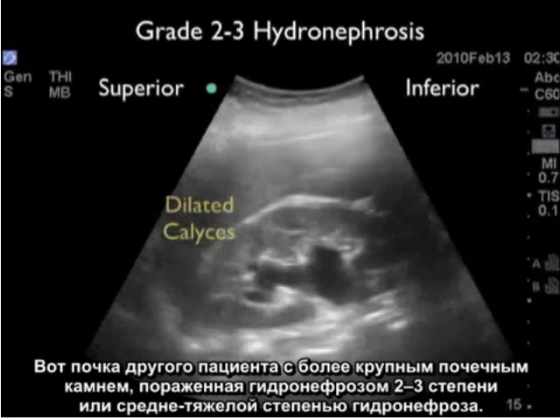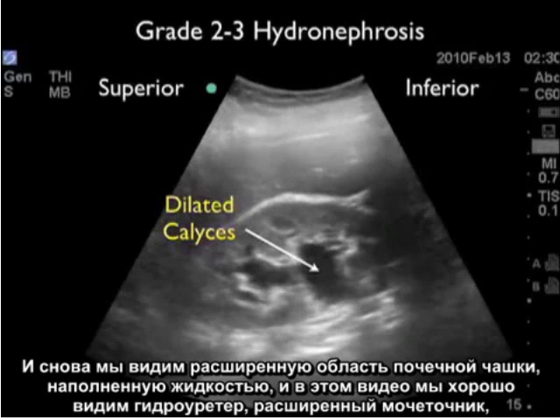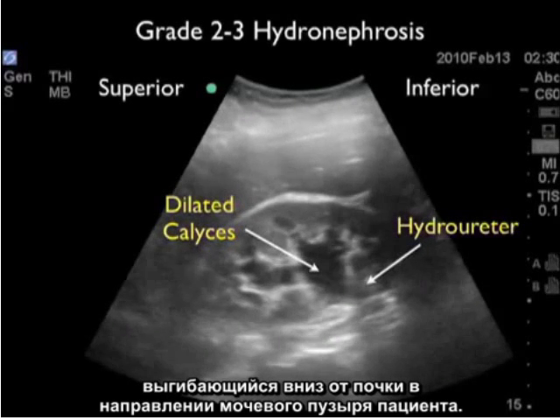Here's a kidney from another patient with a larger kidney stone representing a grade 2 to 3 or moderate to severe hydronephrosis. And again, we see the dilated calyceal region filled with fluid. And in this video clip, we see the hydroureter, the dilated ureter, arching inferiorly away from the kidney down towards the patient's bladder.